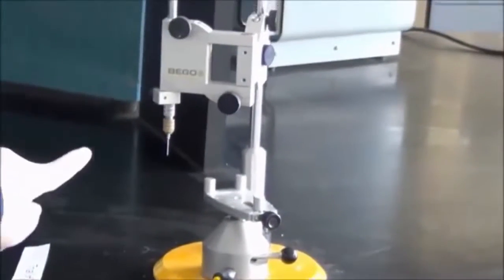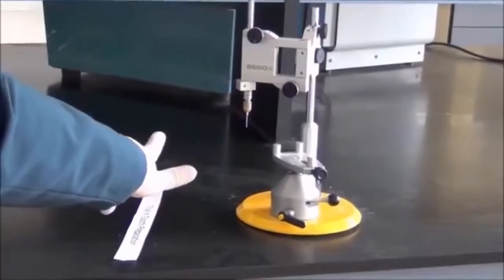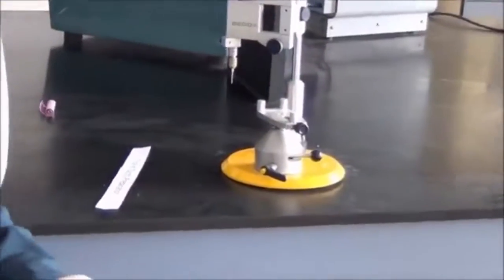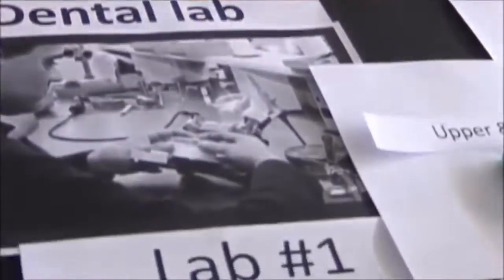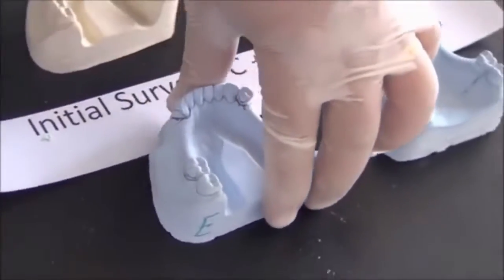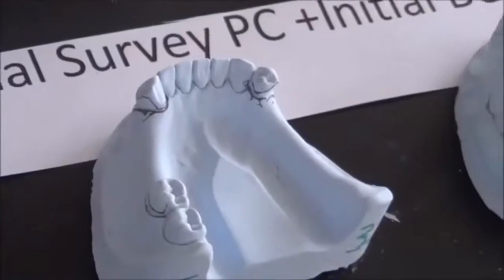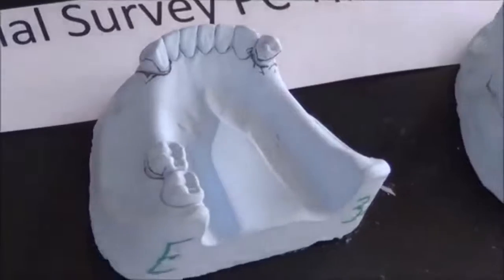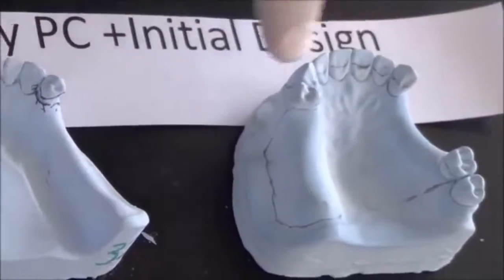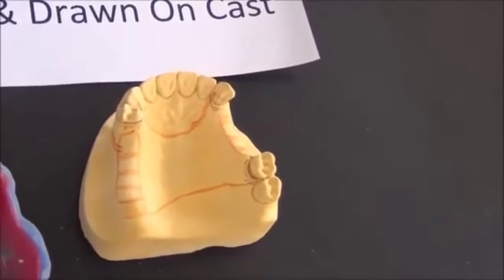You will take the process of surveying in detail in the next demo. This instrument is used for recording and trying to analyze all of the components of the RPD. Once we finish the surveying, we will have some lines drawn on the cast, mainly the survey line. We would have found undercuts suitable for our design. We complete the drawing, trying to draw other components of the design until we reach this design, which has all of the components drawn on the cast.